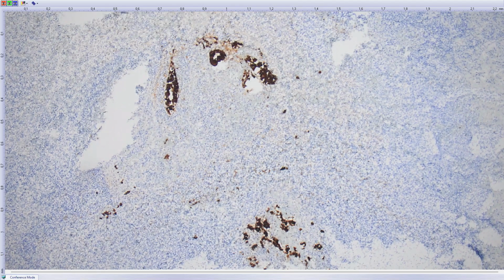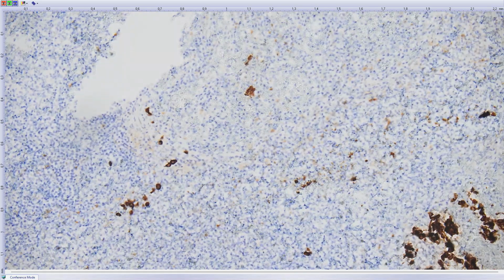You can find it in your routine material as well. Just take fibrous appendicitis. Yeah, it is usually final stage of inflammation of appendix, and you see these single cells positivity here in between the inflammatory tissue. The same cells are very nicely immunohistochemically positive for synaptophysin and chromogranin.